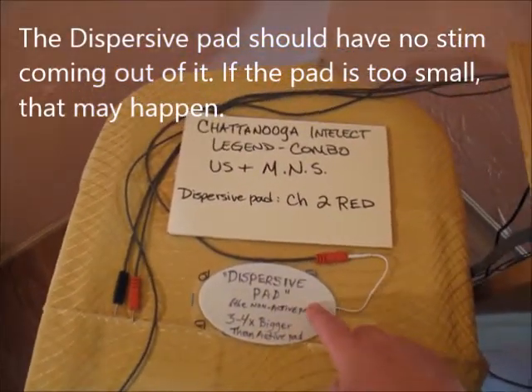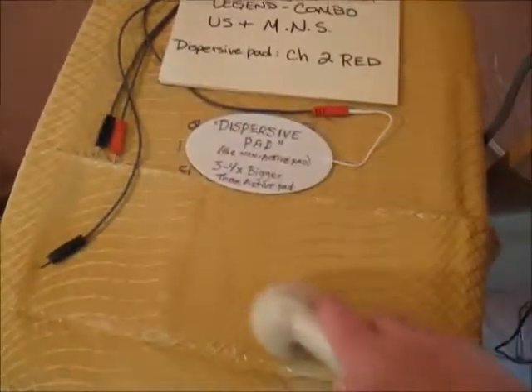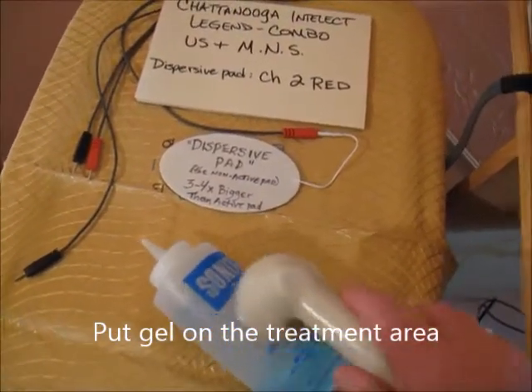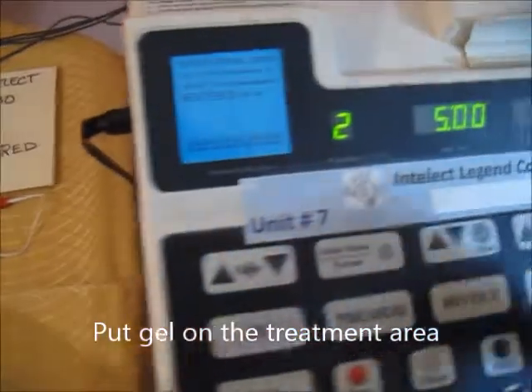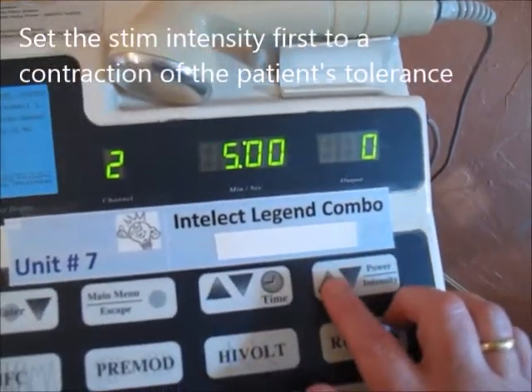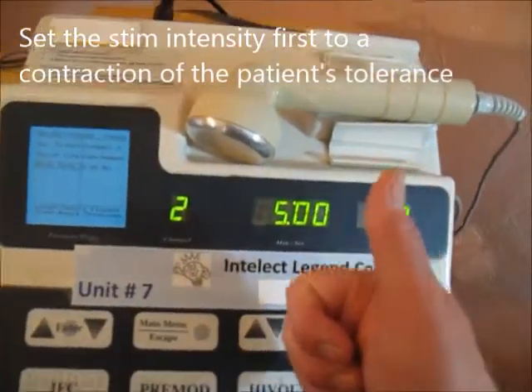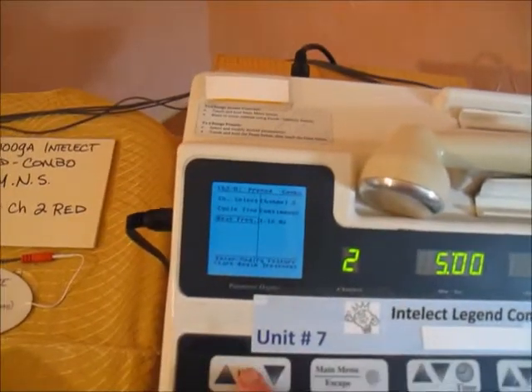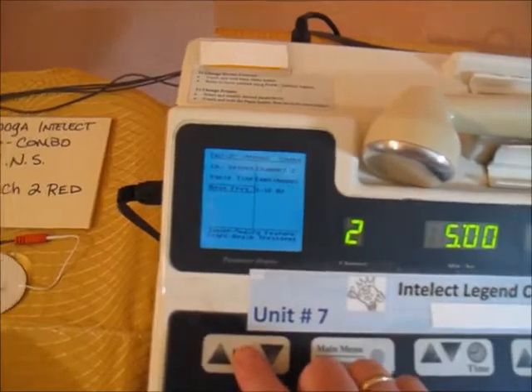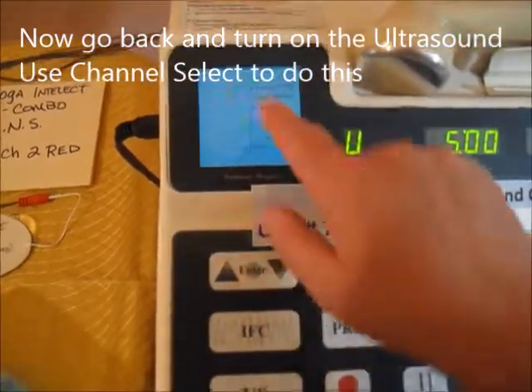Place the pad on the body part with gel applied. Go up in intensity until the patient feels a comfortable, tolerable contraction. Once you've set that intensity, go back to channel select and switch back to ultrasound.